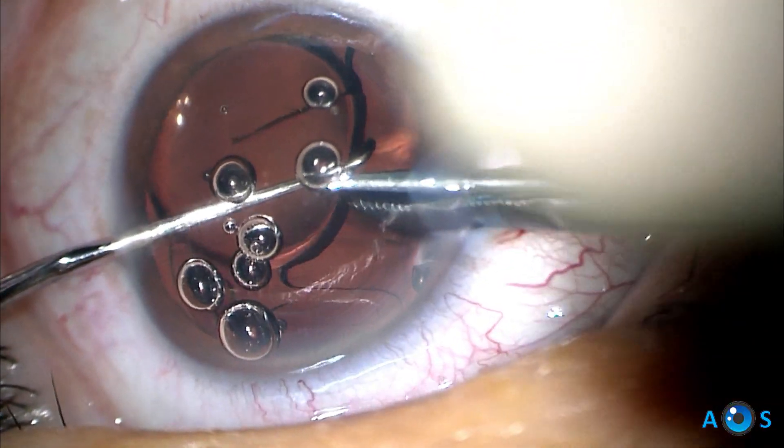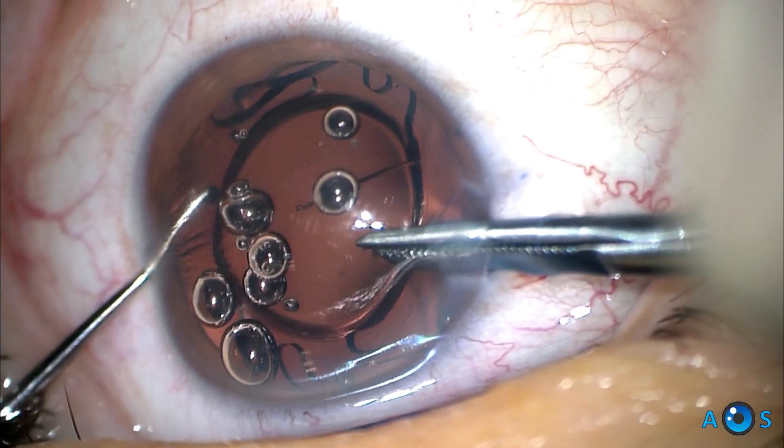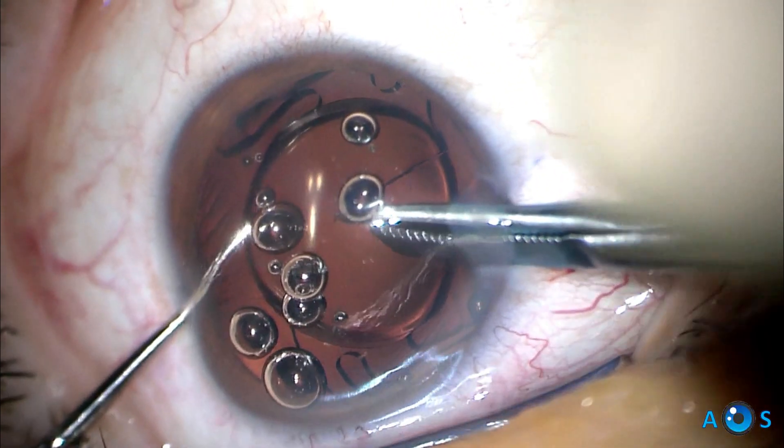This is a delicate maneuver. The second instrument should alternate between being placed above the optic to protect the corneal endothelium, and also gently pushing the IOL towards the cutting scissors.